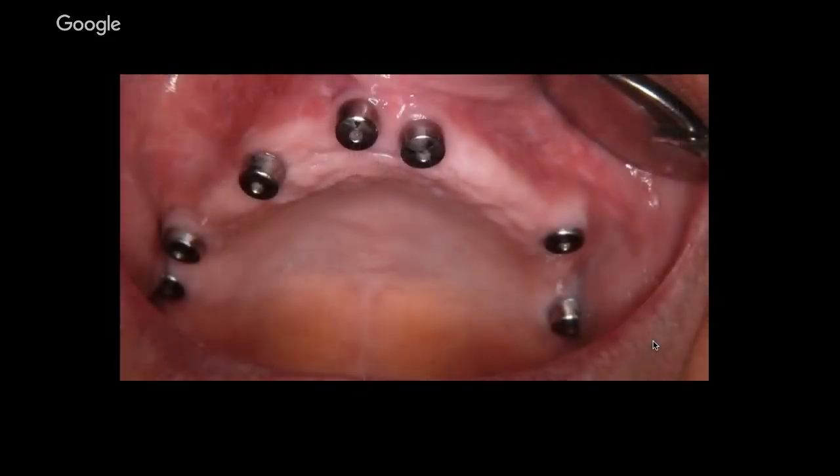For both fixed and removable dentures, the implants are not positioned correctly. When considering overdenture, such types as bar or ball attachment are not an option. Only one option is left now: telescopic retained overdenture. And for telescopic retained overdentures, all we need is perfectly parallel abutments. The thing that could be said for this picture is that it is only possible with custom production methods.